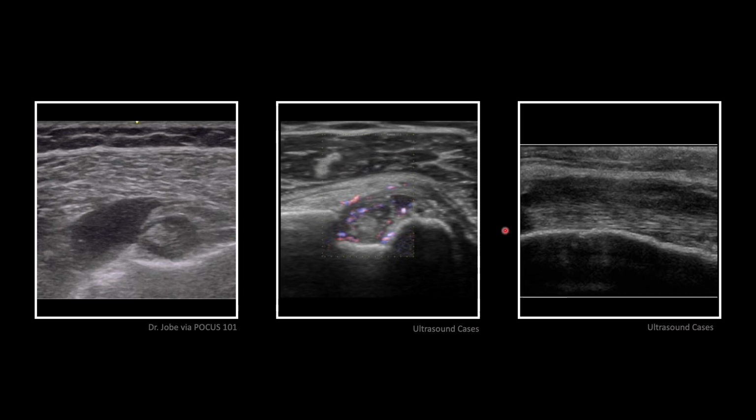And then lastly, in the image on the right, the biceps tendon is seen in the long axis with tendon thickening. So this is much thicker than what we would normally see for the tendon. And there's possibly a hypoechoic defect as well, maybe right over here. In this case, the findings are pretty chronic and suggest a long-standing biceps tendinosis. And so these three things of seeing fluid collections, thickening, and hyperemia are going to be present in every single tendon and muscle that we look at that can get injured. It's an important triad of findings that I want you to solidify as you investigate various structures.